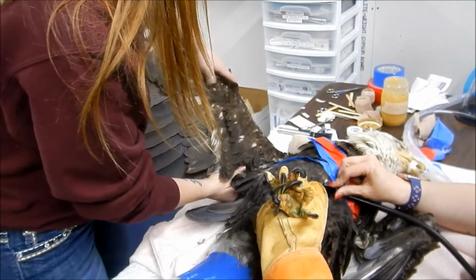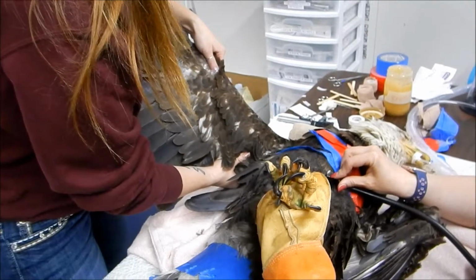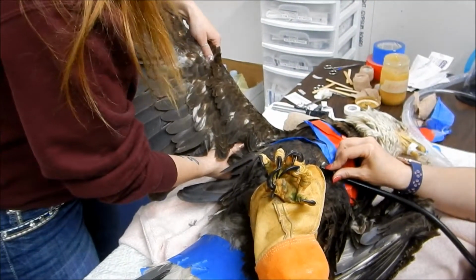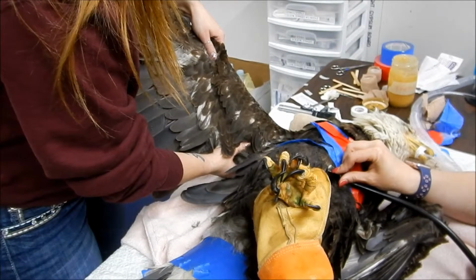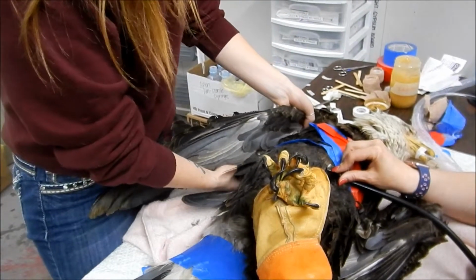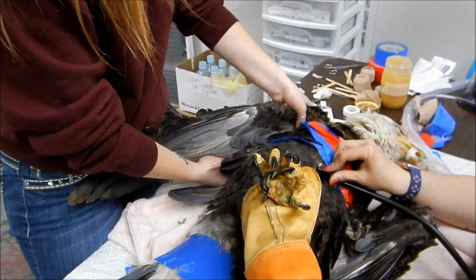So we are doing this physical therapy under anesthesia. Physical therapy has been done while the bird is awake, but eagles are very large, cumbersome, and it can be more difficult to do it while they are awake. Also painful, so if they're under anesthesia, then they're not feeling any of that pain, they're not remembering what's going on. So it's much easier for the bird, easier for us, and less stressful.